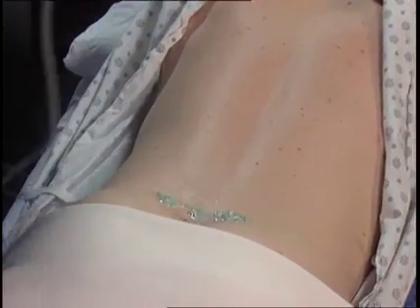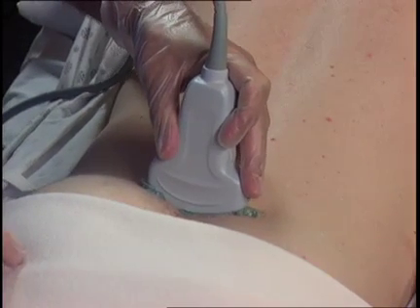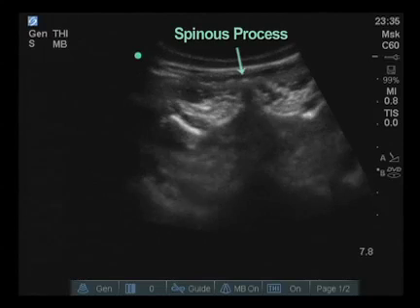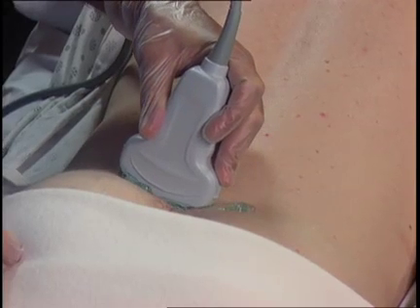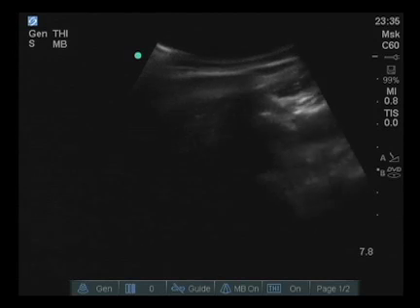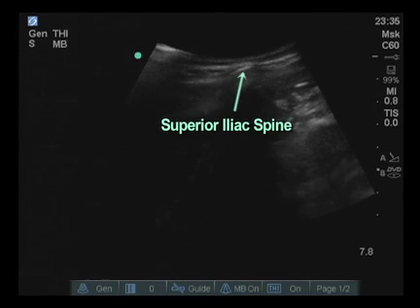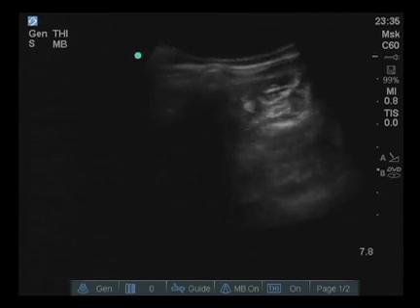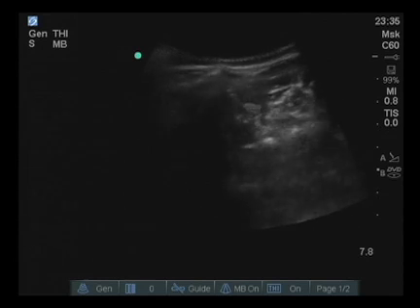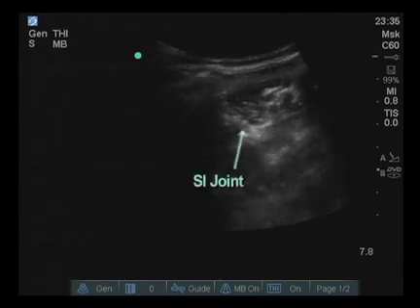orientation, approximately a centimeter or two above the beginnings of the gluteal folds. And I've found the anatomic midline by identifying the spinous process of the sacral plate. As I roll the probe laterally, the posterior superior iliac spine comes into view very clearly at the top of the screen up here. The space between the posterior superior iliac spine and the shadow cast by the iliac crest and the sacrum as it dives down represents the sacroiliac joint. And you can see that in the center of the screen.